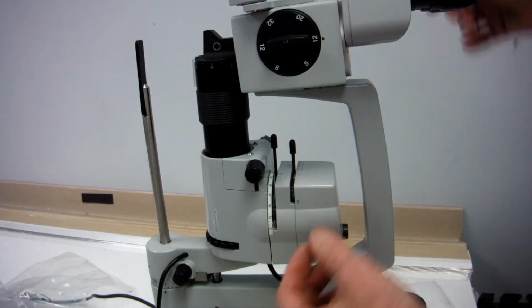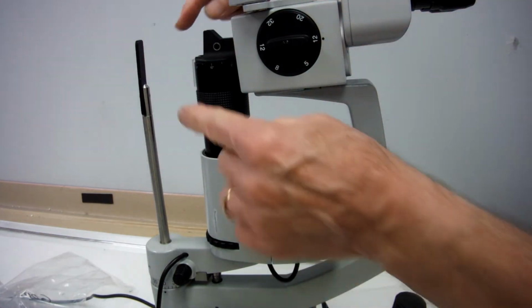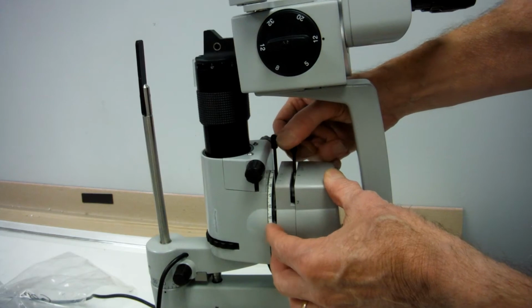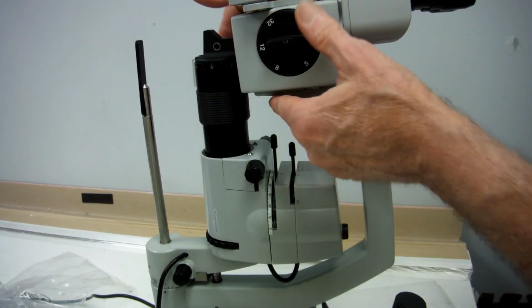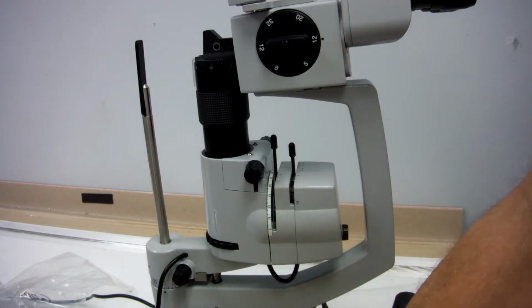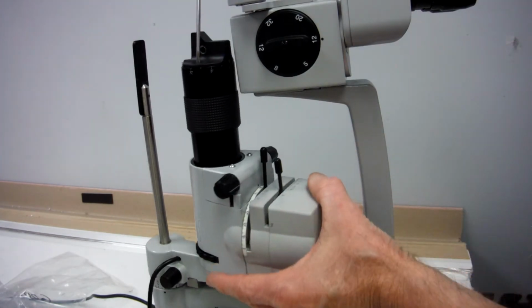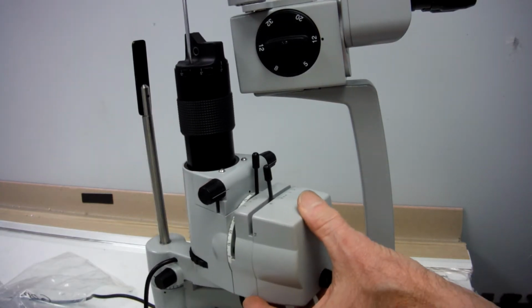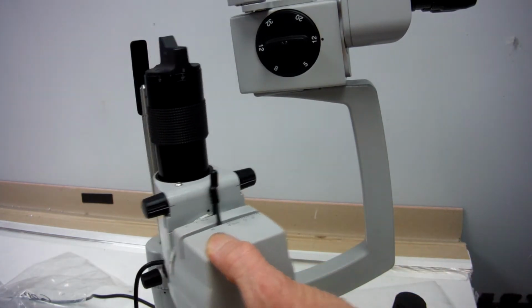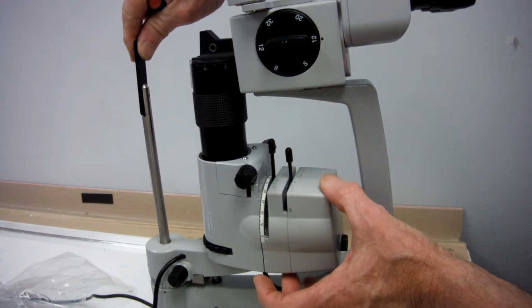And when you turn it on, leave it at 12 and put your aperture on the largest aperture and look through the view, and if it needs to go left or right, you can unscrew these two screws on your prism hood, on this tiltable prism hood. Loosen those on each side and you can turn it left or right to get it in the center.